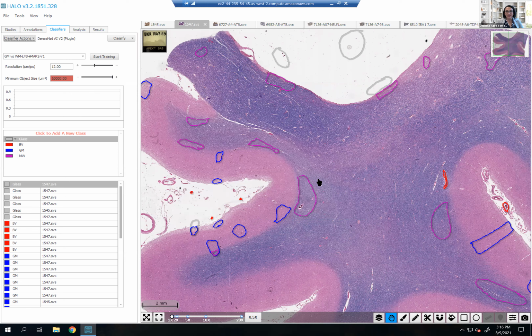So in this case, I can train the computer adding more information. It's important when you use deep learning that you enter the classes from the least important to the most important one, because when you do that, it's going to classify in that exact same order.